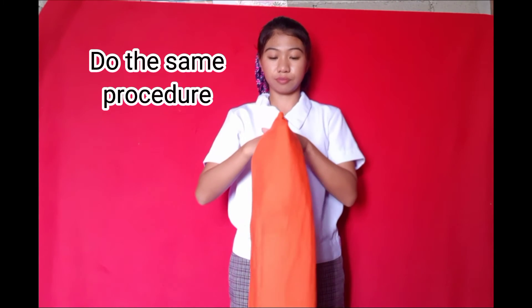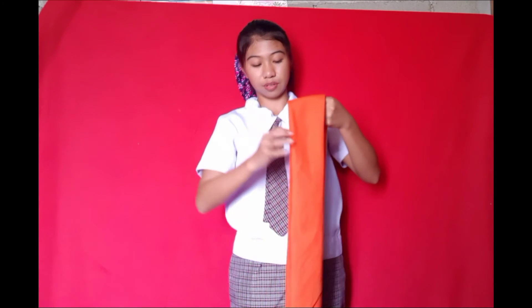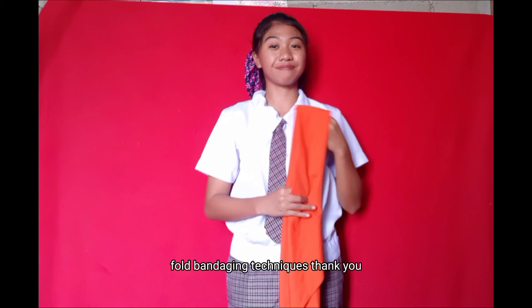Let's do the same procedure, and this is now our cravat face. So this is the fold bandaging techniques. Thank you.